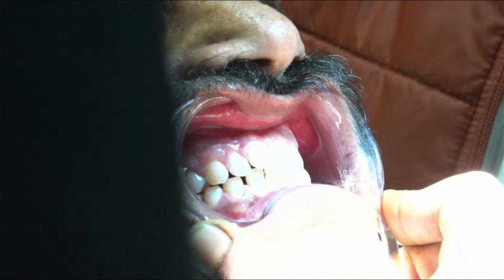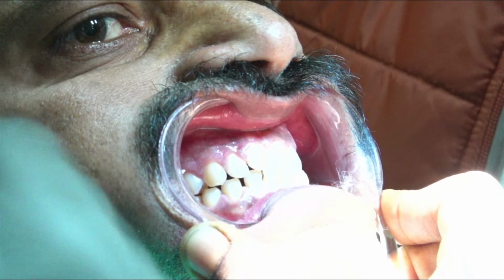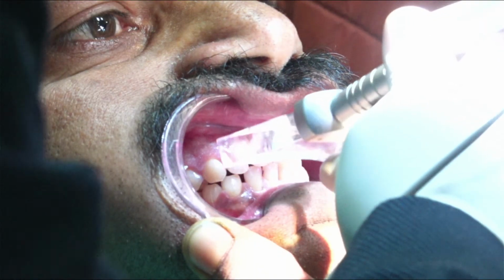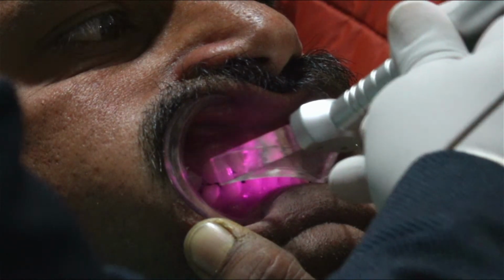Very simple. Okay. See here, where is my laser? It is not pointing towards the patient's eyes or my eyes or your eyes. Right? I will catch it here and then directly take it here like this and then release it. Right? You have to go to the website, Vault, and read laser safety guidelines.